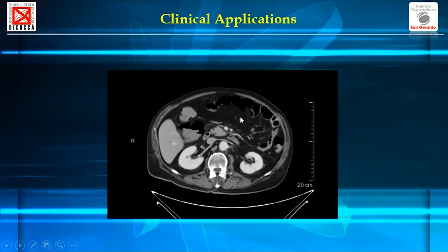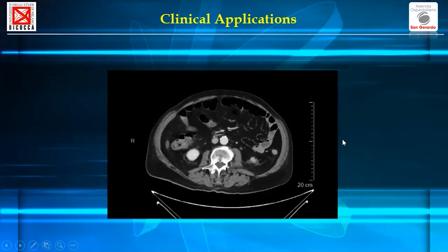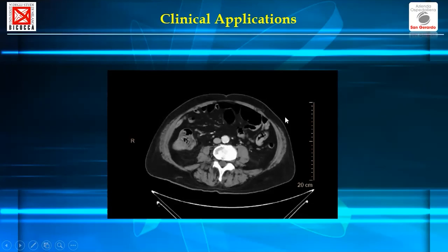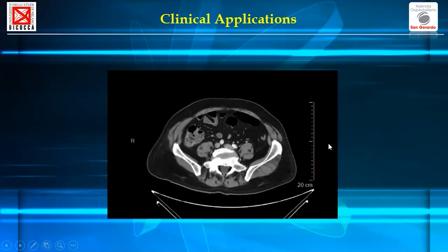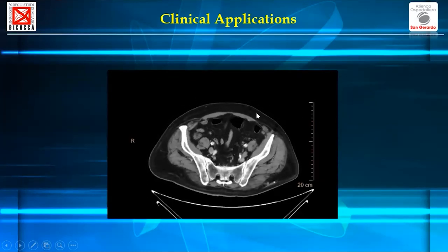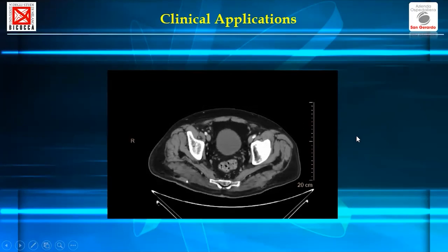We have adenomyomatosis of the gallbladder, a cortical defect in the right kidney, no fluid, no mass, only focal atheromatous alteration on the aorta. But I think that everybody considered this examination as negative, like me.